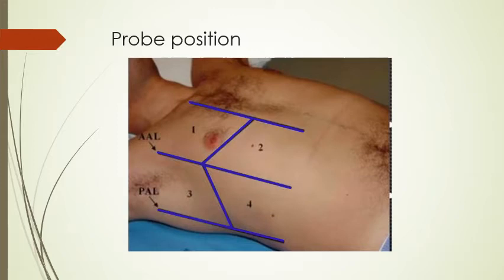Where Volpicelli zone 1 represents the upper blue point and Volpicelli zone 2 represents the lower blue point, the Volpicelli zone 4 is the PLAPS point, and finally the Volpicelli zone 3 gives us another view of the posterior parts of the upper lobes.